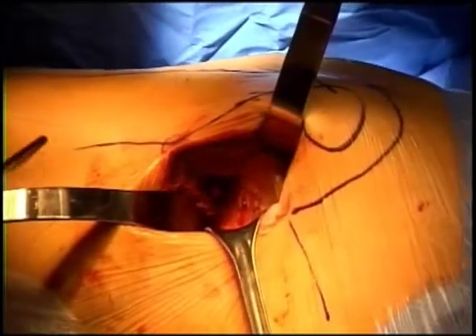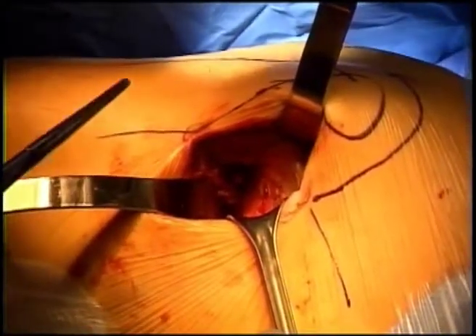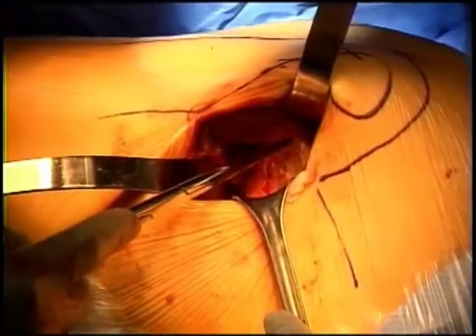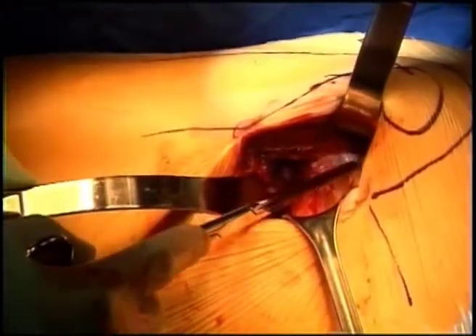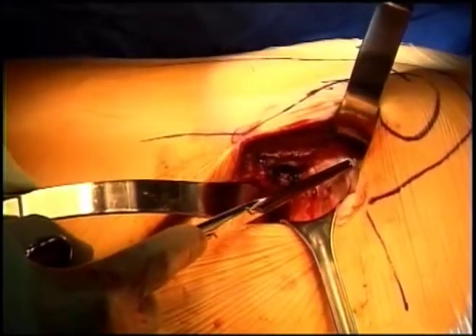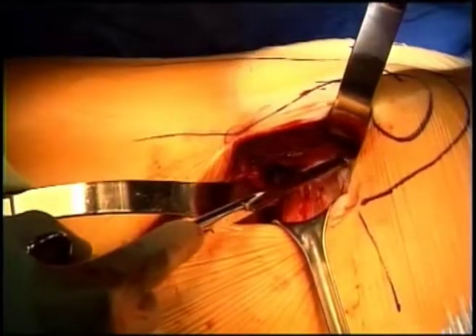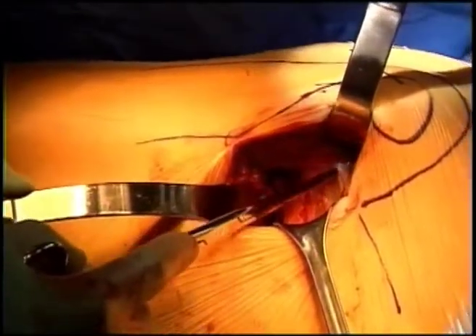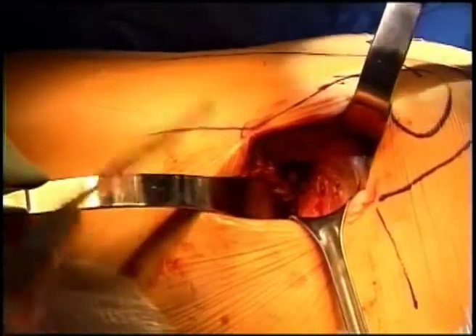The advantage of this minimally invasive approach is that through a small incision and splitting of the gluteus muscle, it allows us to expose the deeper structures of the hip. This tendon is called the piriformis tendon — it's part of the rotator and stabilizer of the hip joint — and there's an additional tendon called the conjoint tendon just below it. We're going to take these down off the bone and repair them, which helps to improve function and stability of the hip replacement.